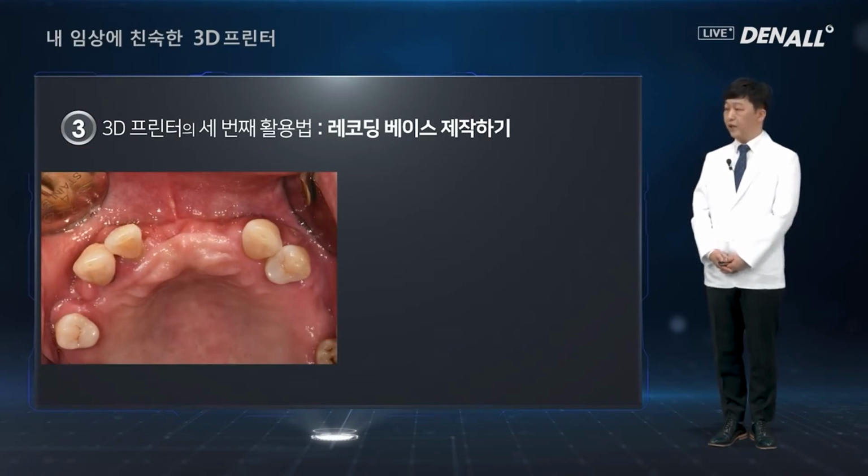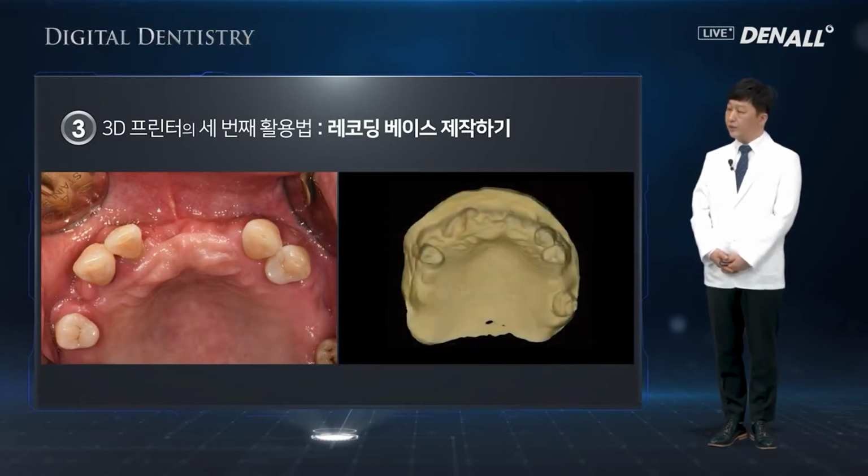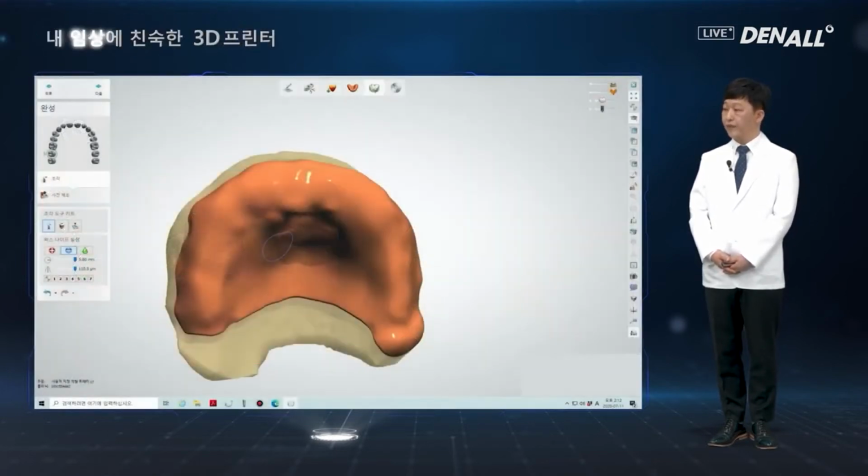The third 3D printer usage is to fabricate a recording base. Before extraction, this situation is made into a model. On the model, the teeth were removed. A temporary denture will be delivered right after extraction.